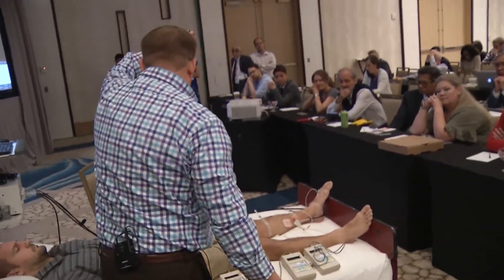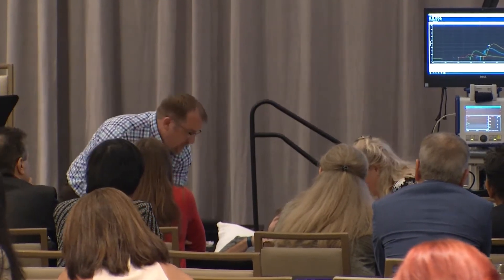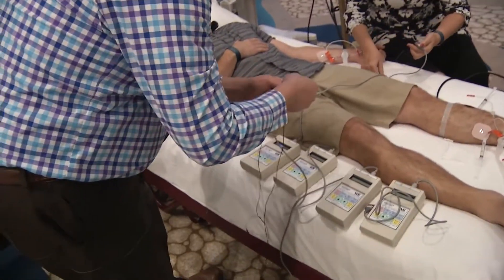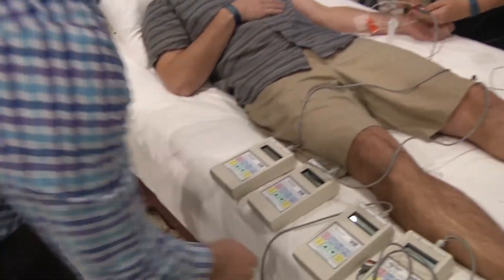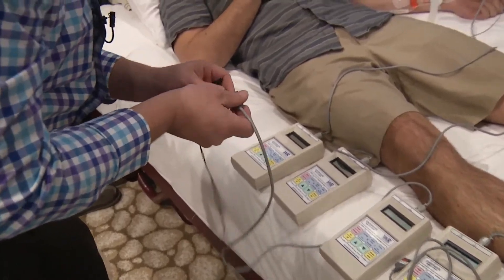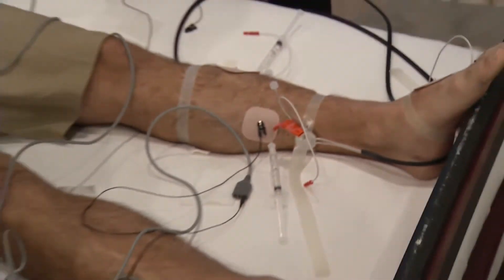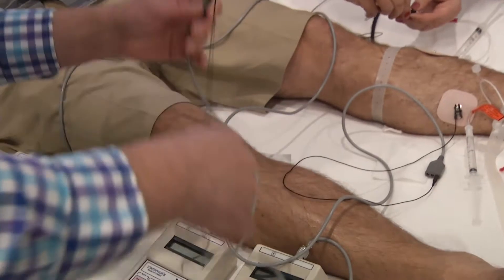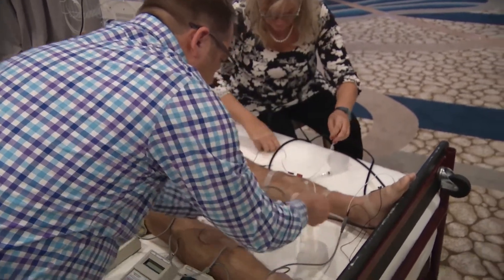We're going to attach both connections — black to black, red to red. One other thing to keep in mind is that just like for nerve conduction studies, skin temperature does play a role, particularly at the foot site. Ideally you want to keep the skin temperature at about 32 degrees Celsius. You can utilize a heat lamp or any other option to warm up the skin a little bit before the test.